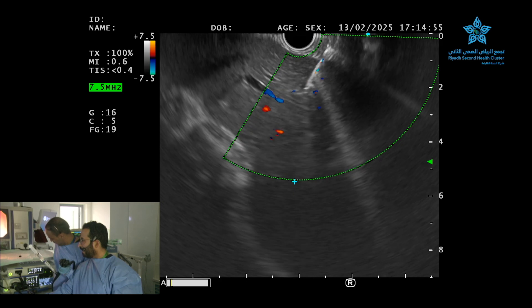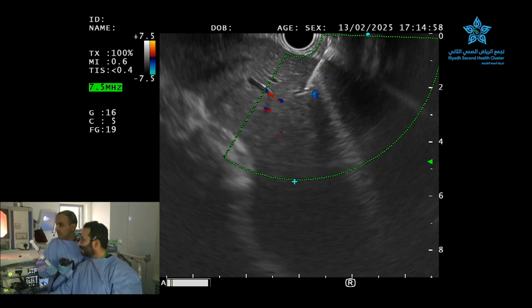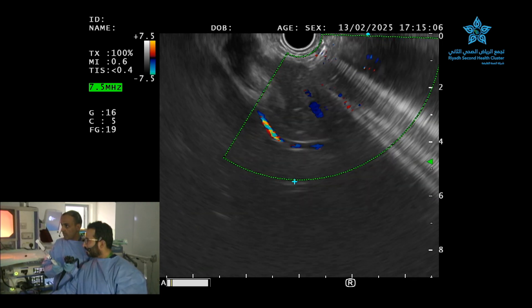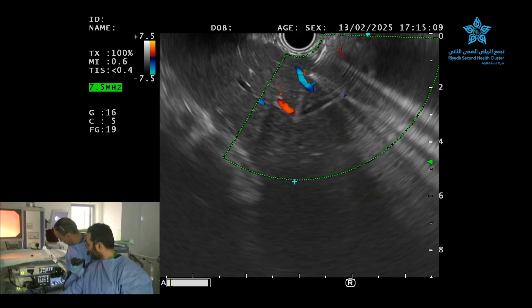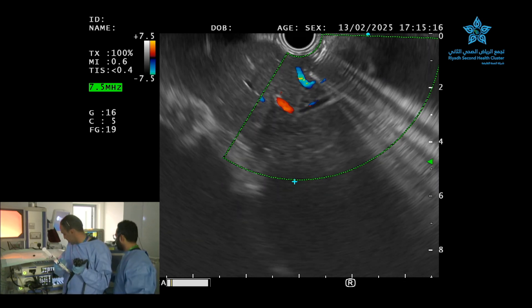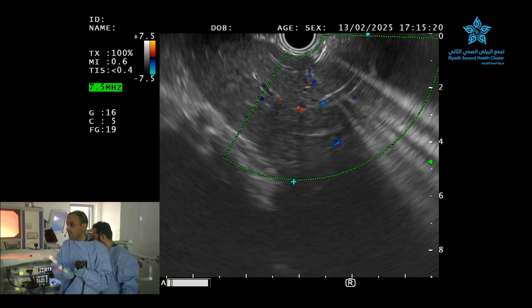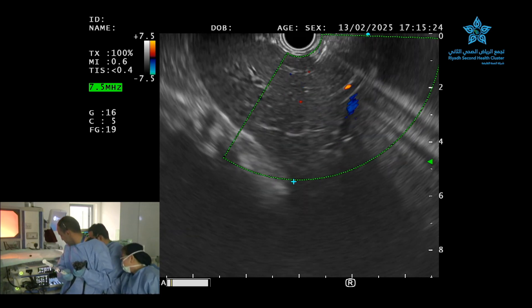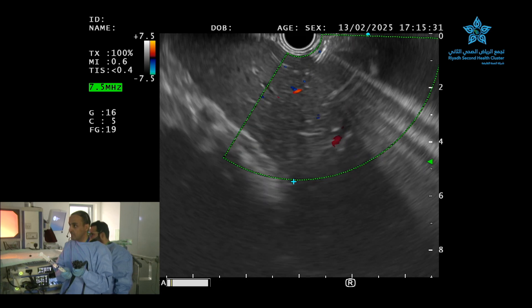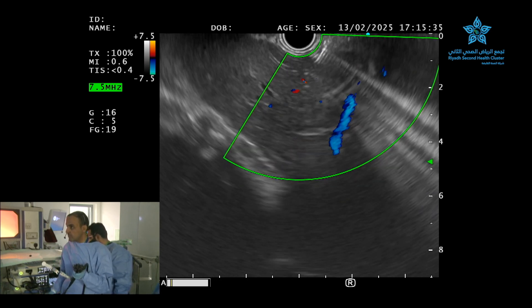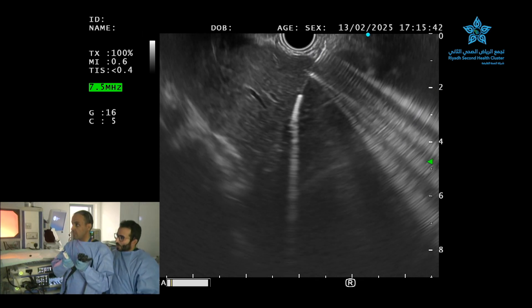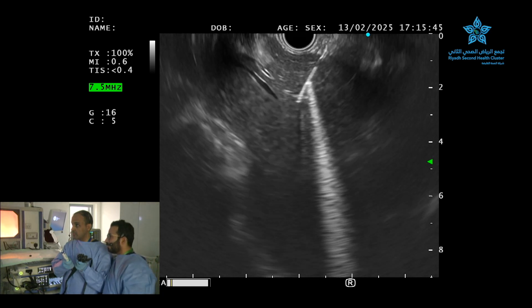We can see the needle going in. We will advance the needle all the way to the opposite side. Removing the Doppler flow will help visualize the tip better. We can now see the needle — it is at least two centimeters into the hepatic parenchyma.